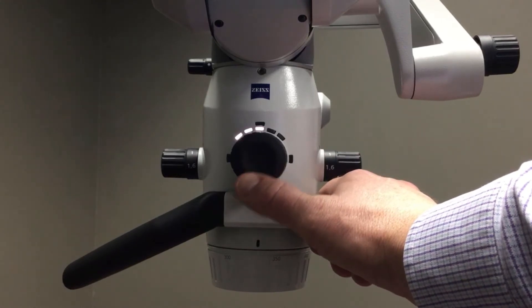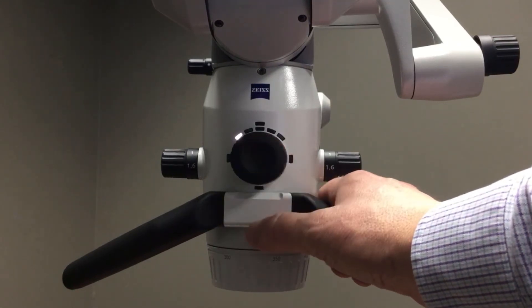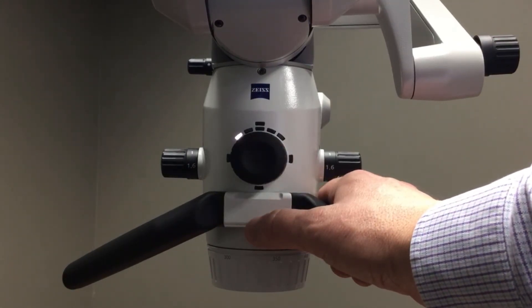To turn off fluorescence mode, I simply tap down in the six o'clock position, and my microscope will go back to the last illumination level that I had with the standard light.